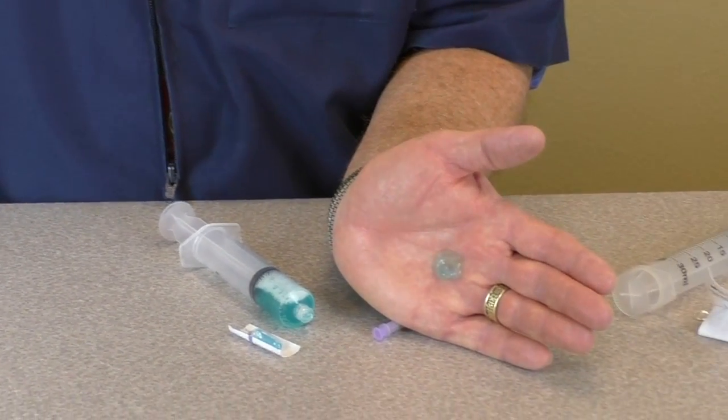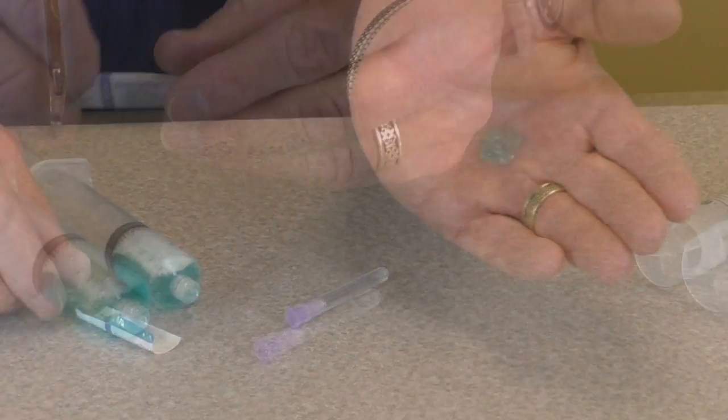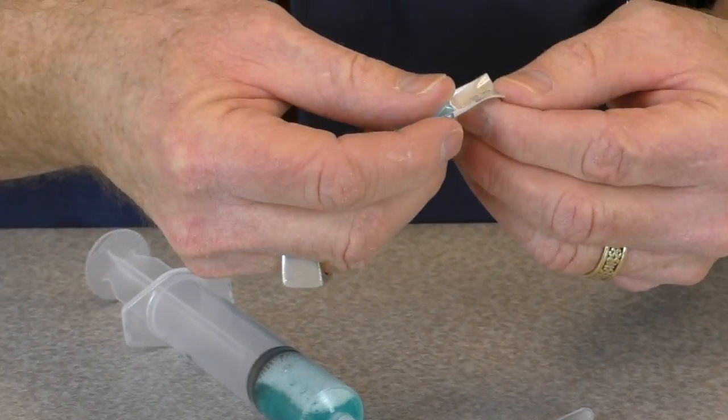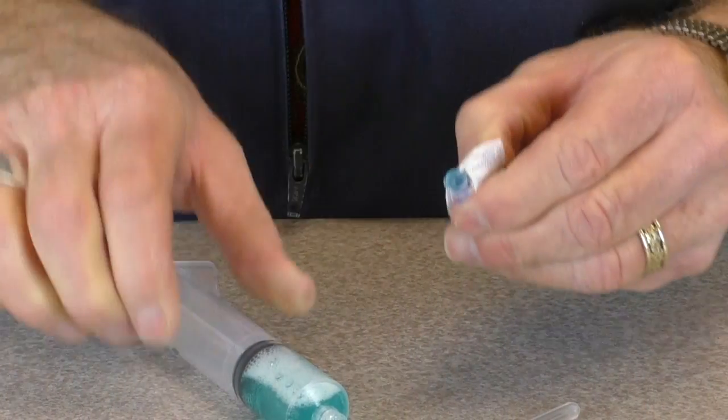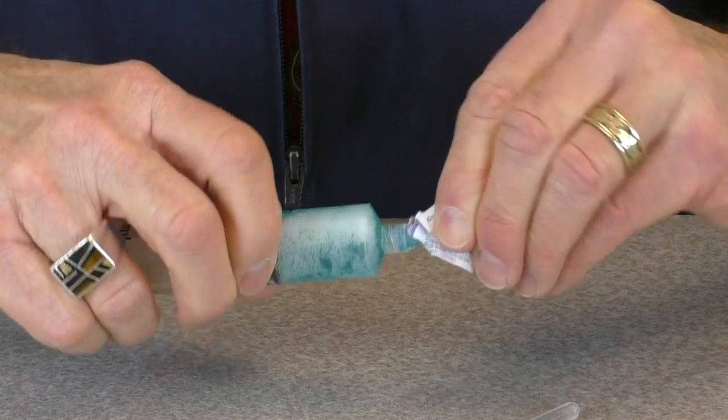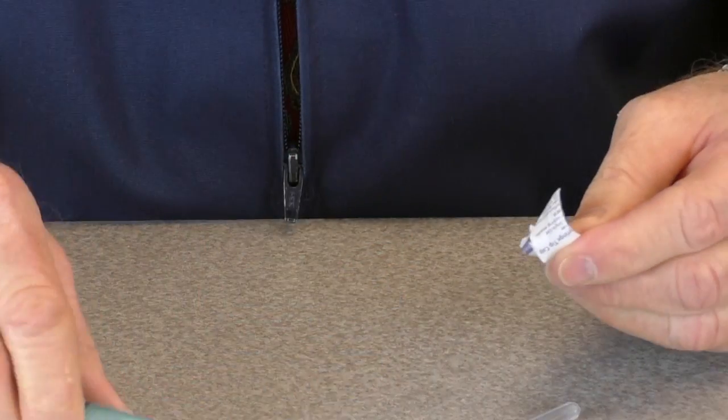Be sure to check the poloxamer vial to ensure that it is liquid before starting. If the product is getting warm or you have created a lot of foam, attach the enclosed blue cap to the end of this syringe and place the entire mixture back in the refrigerator until you are ready for it.